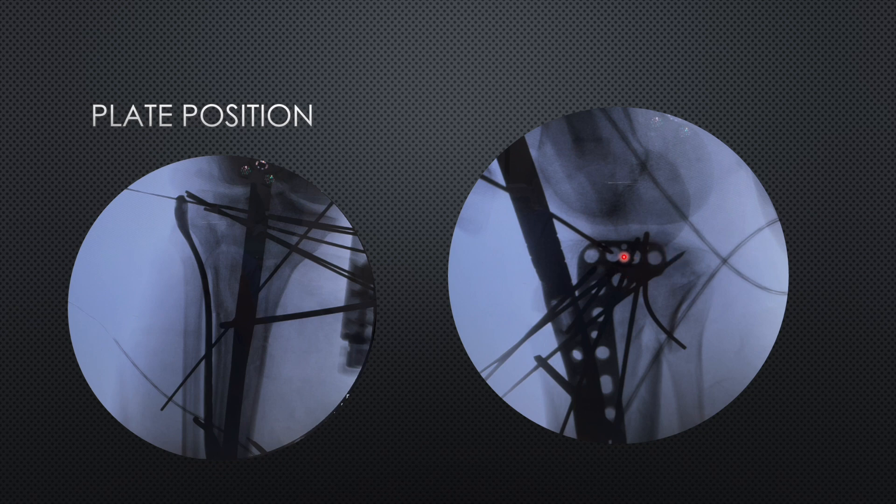Whenever the depressed fragment is posterior, keep the plate as posterior as possible. Exposure should be adequate over the fibular head so you can palpate up to that area when placing the plate — this allows you to push the plate as posterior as possible for good rafting. The plate also needs to be central in the distal part. Then sequentially start placement of screws. If the drill bit hits a K-wire, simply withdraw that wire, but do not withdraw all K-wires at once. Place a screw, remove one K-wire, place another screw, remove another K-wire — this keeps the reduction secured.